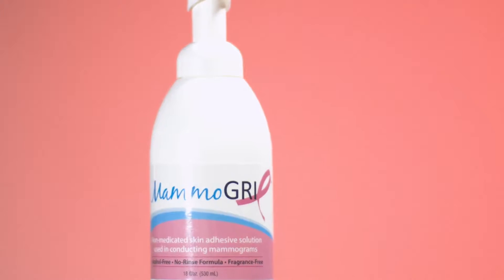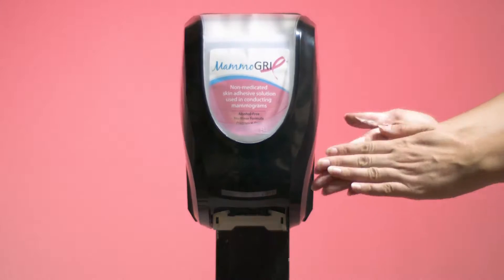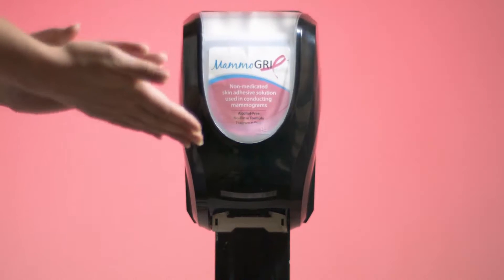Created by technologists for technologists. Mammogrip — add it to all your procedures for every patient and every image. For more information, go to mammogrip.com.